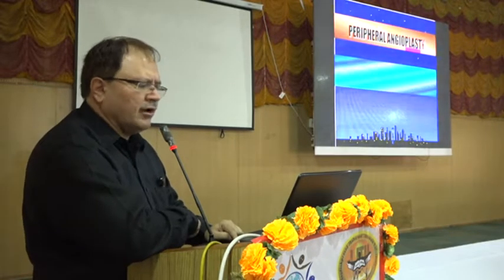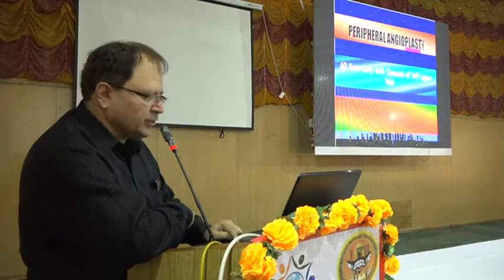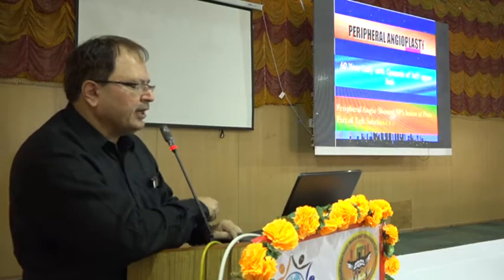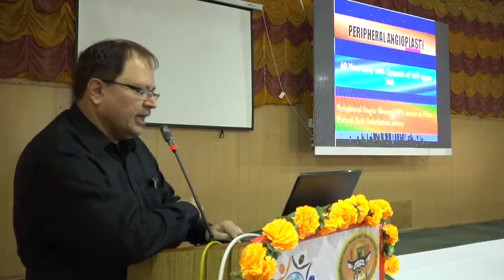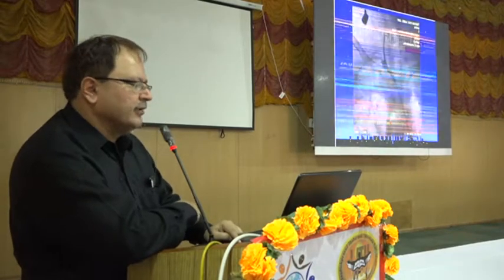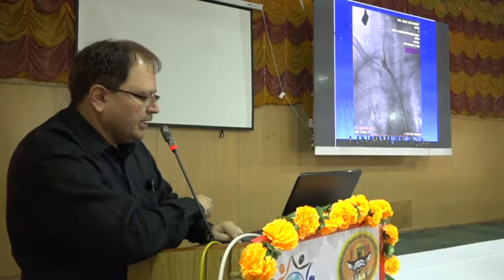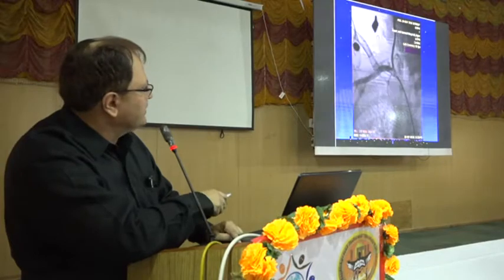Similarly, we are also doing a lot of peripheral angioplasties. We have got newer stents for peripheral angioplasty. Like a 60-year-old lady with claudication of the left upper limb; peripheral angio showed a 99% lesion at the proximal part of the left subclavian artery. So we did the angiogram. The left subclavian artery is almost 99 to 100% occluded, and we did the angioplasty. You can see the absolutely clear artery here, 100% clear.